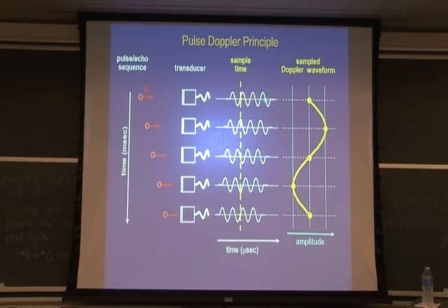of transmitted sound waves to a moving subject which is moving towards the probe, and it causes a shift in the transmitted frequency. If we sample them at one time point, the so-called gating, then we can obtain a frequency curve with their amplitude.